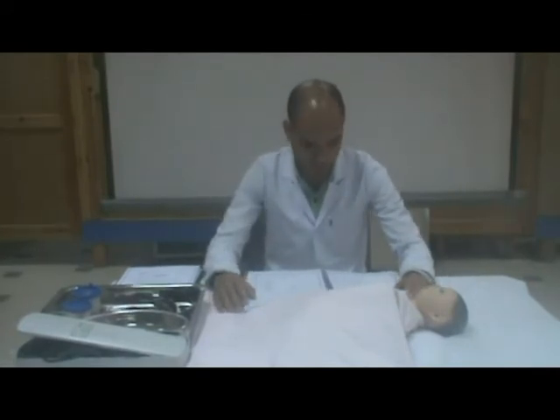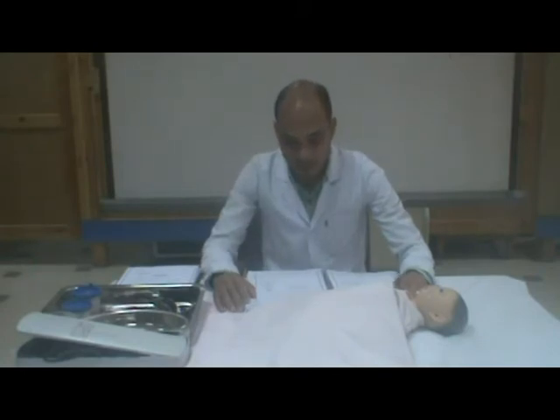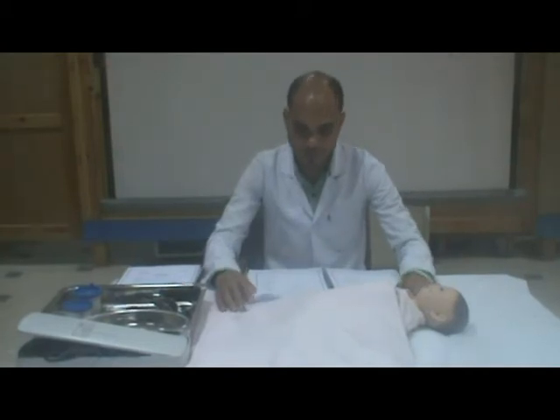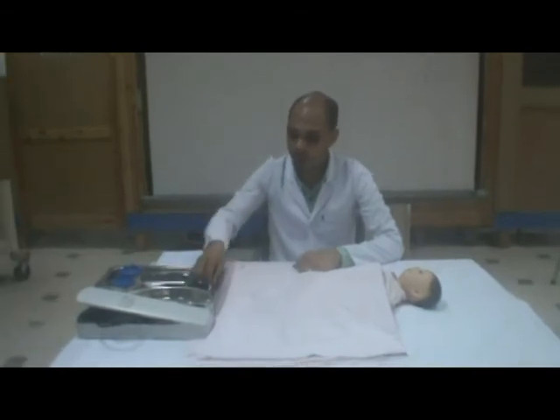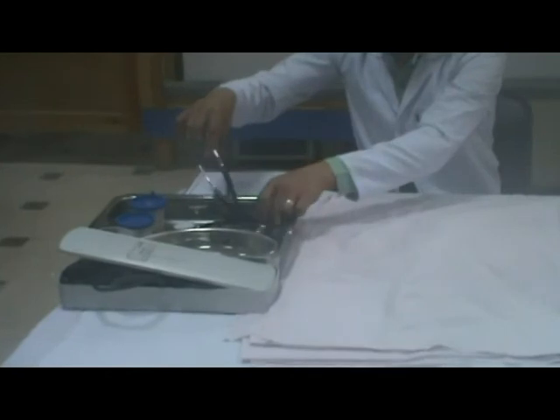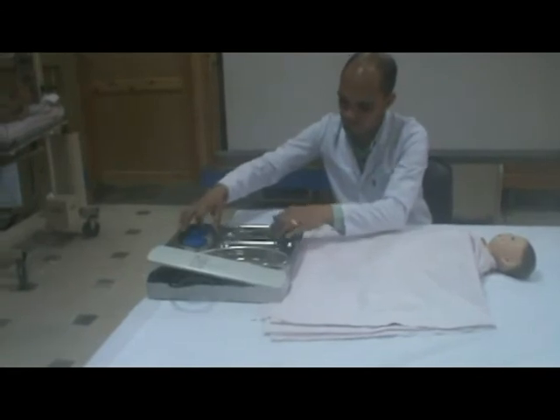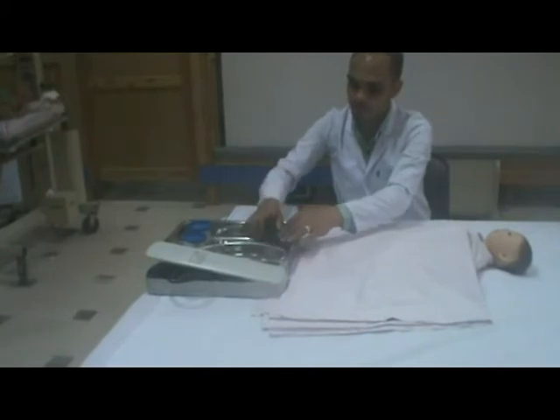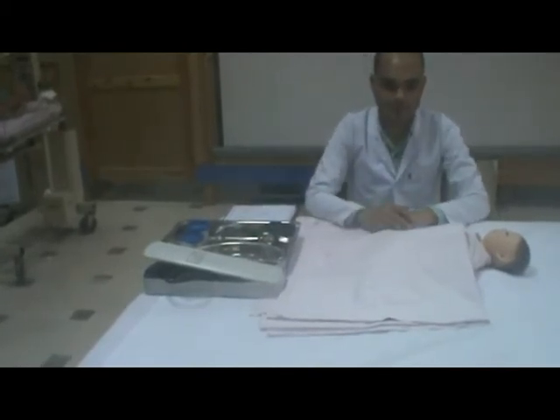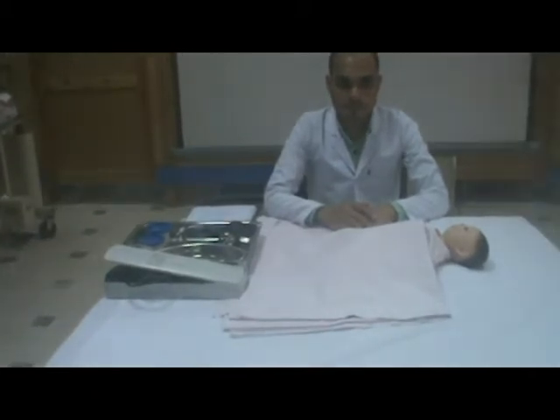Number 2, pulse. Definition: the pulse is a pressure wave of blood caused by alternating expansion and recoil of elastic arteries during each cardiac cycle. Equipment: watch with a second hand or digital readout, stethoscope, antiseptic swab or cotton with alcohol. Now look at your procedure book for sites of taking pulse, radial or brachial pulse.